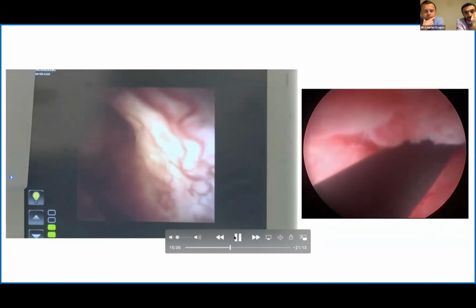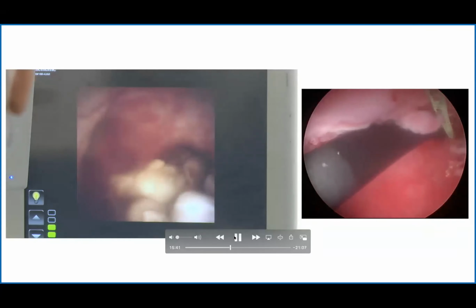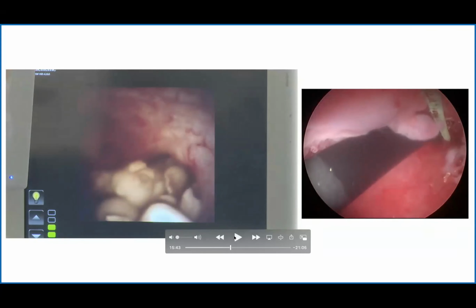Sorry, I was just going to say, Azad Hawizi has asked another great question, which I completely agree with. He's saying that when you've got the Amplatz sheath in, sometimes it's really difficult to navigate the kidney with a ureteroscope or a flexible nephroscope because of bleeding and collapsed calyces. And I must say that the view that you've got is certainly much better than the view that I normally have when I try and do that. So, what have you done differently? And have you got any tips as to how you can help people to improve the visibility and to stop this collecting system from collapsing when you're doing a flexible ureteroscopy combined with a PCNL?